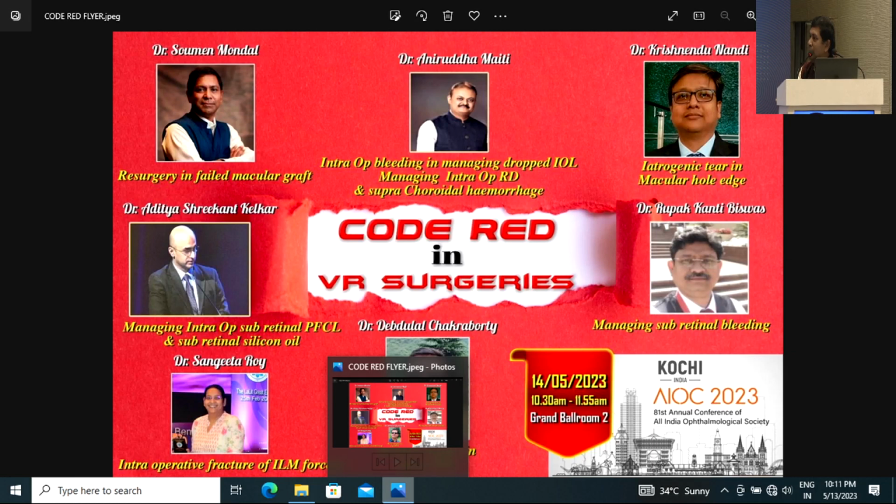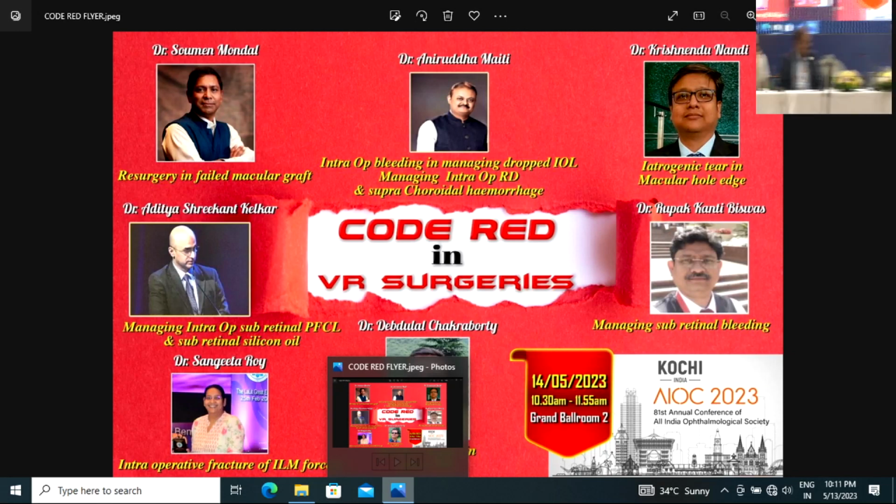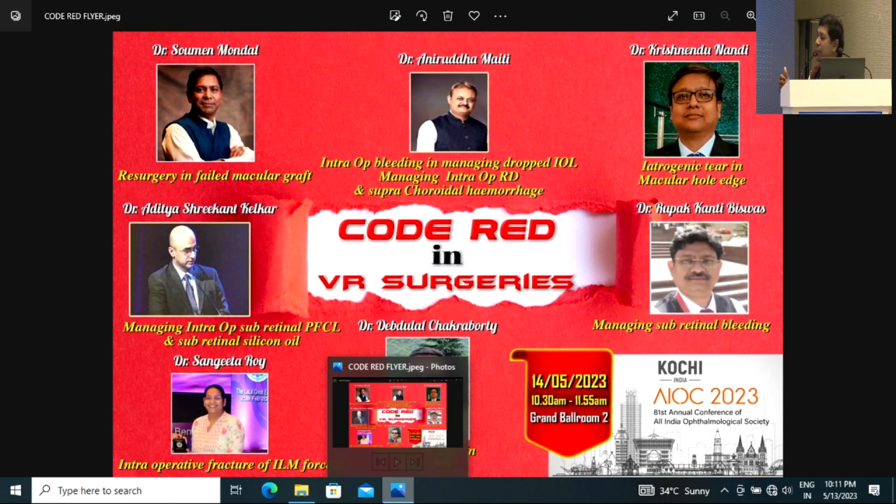Right. And what went wrong the first time when you tried to place this graft? So the lesson learned in this surgery is that when you are putting PFCL, you have to put much more PFCL. The PFCL has to be at least quite an amount higher than the place where you are trying to harvest the graft from. What happened was my PFCL was smaller. I mean, the bubble was less. So when I had finally managed to take the graft from the area where I was harvesting from, it chose to ride above the PFCL. But if your PFCL is enough, then it will never ride. You have taken the graft and you have to drag it at the level of the retina. You shouldn't let it go up.